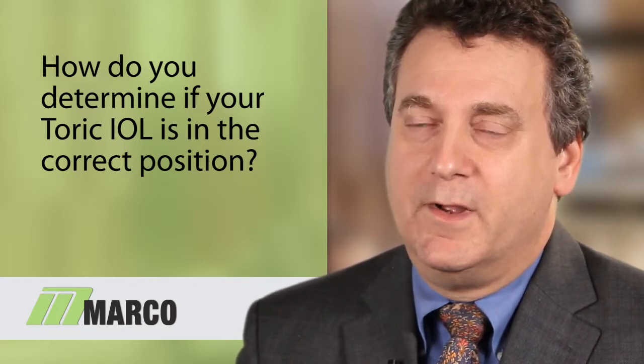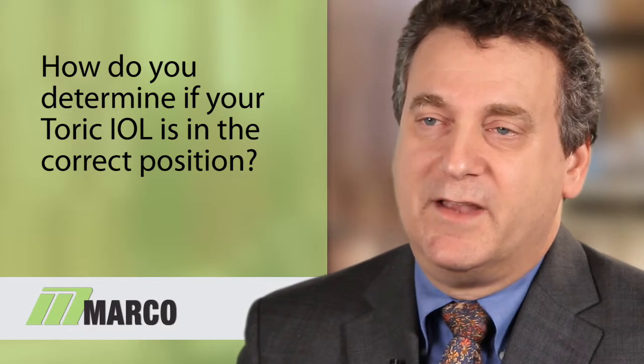That, along with a number of the diagnostic calculators that let you assess how to manage the patient, is really critical in solving these occasional toric missteps that you may see in getting the best clinical result for your patient.